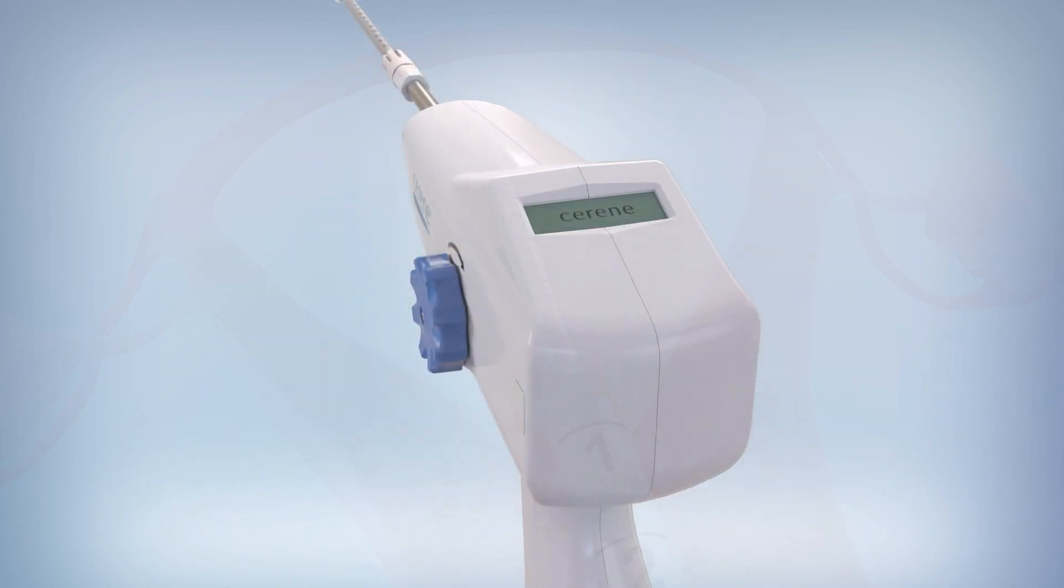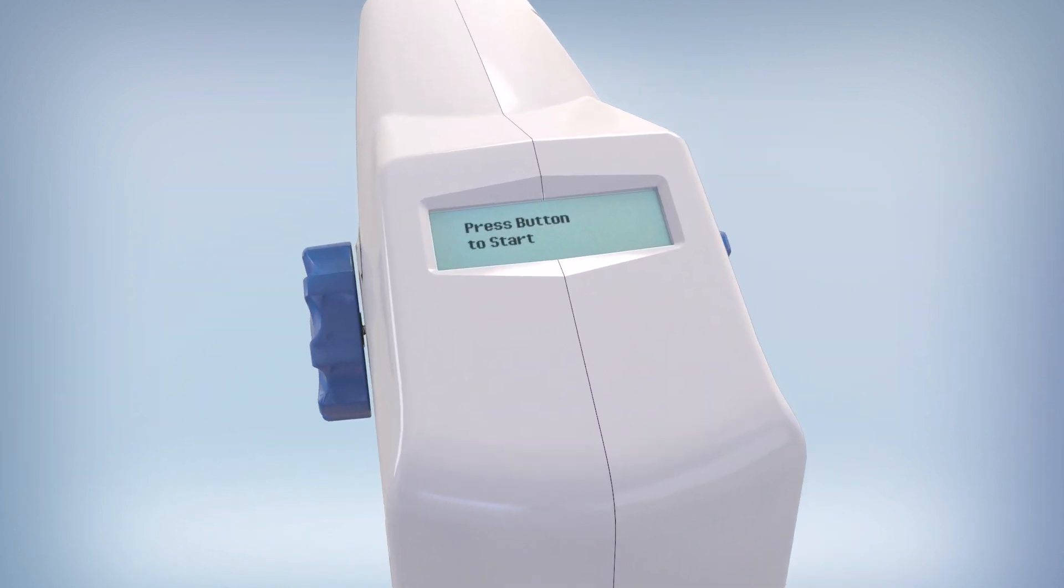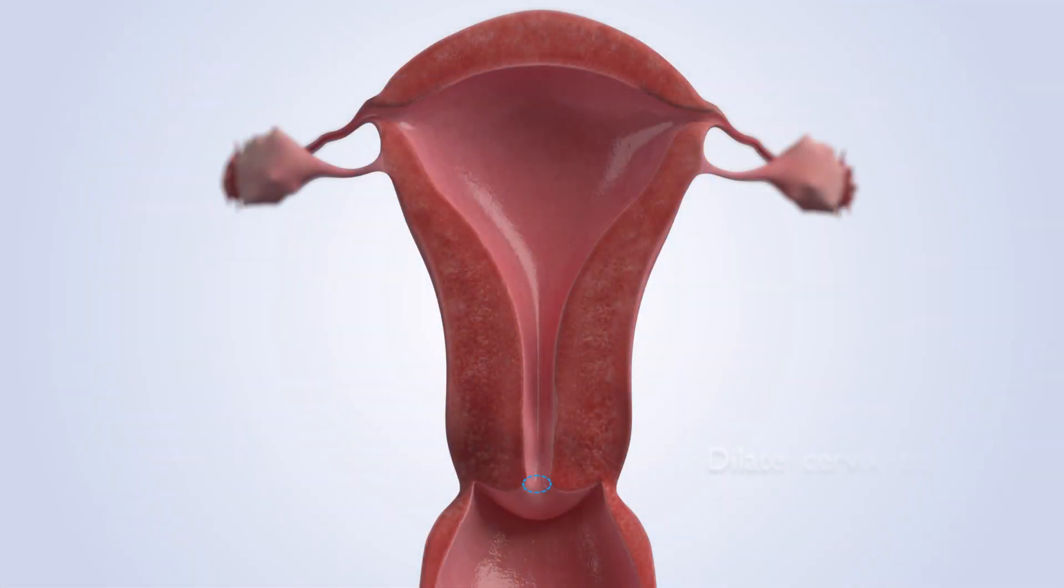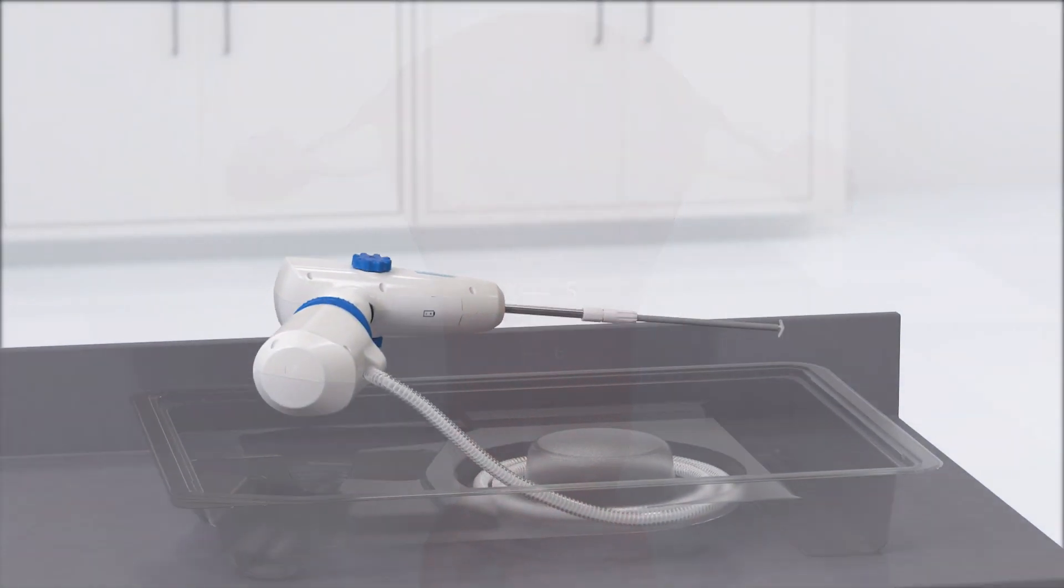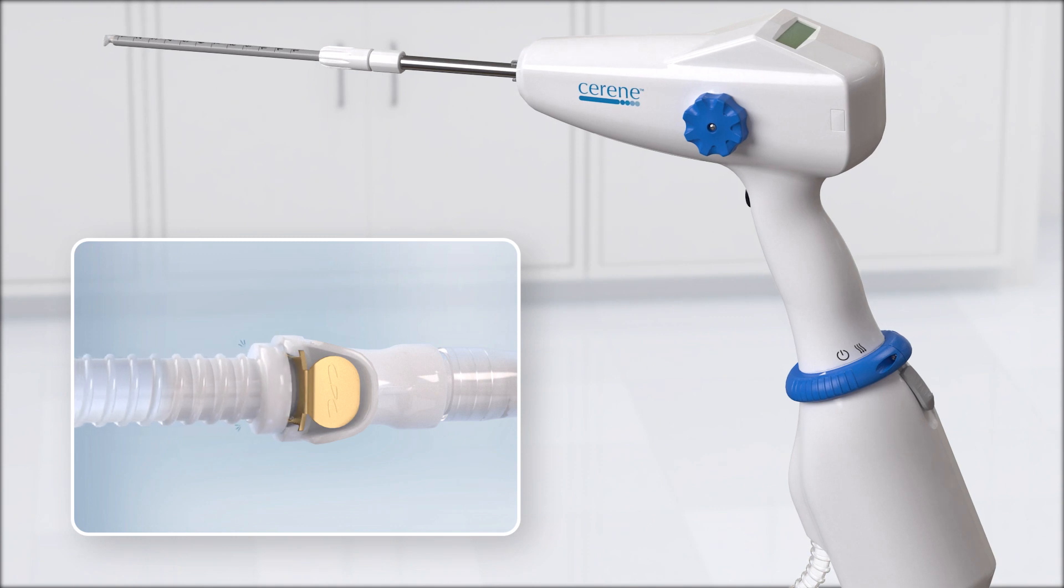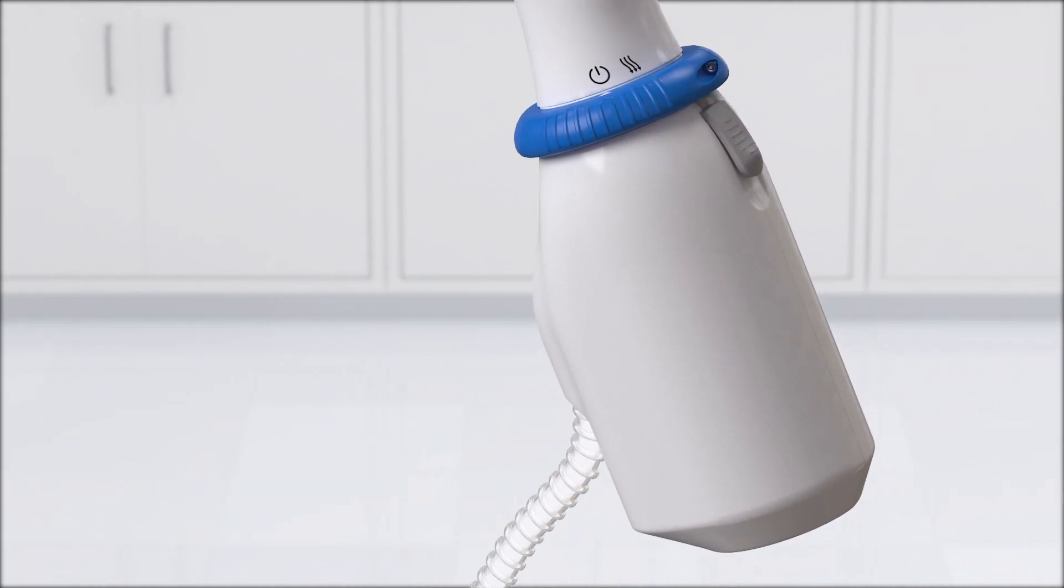The instructions on the LCD screen guide the gynecologist through the procedure. After preparing the patient, gently dilate the cervix if necessary and sound the uterus to determine the length of the uterine cavity. Remove the Serene Device from the sterile tray. Connect the end of the exhaust hose to the exhaust collection bag. Turn on the device by rotating the twist ring.